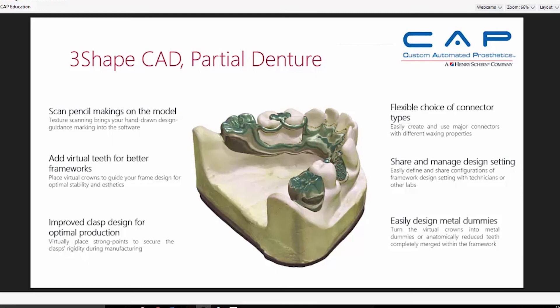Another nice feature 3Shape has added is the ability to add dentition during the design phase, ensuring connectors and mesh work are in the proper places. Especially with the lack of high quality dental technicians in the partial denture arena today, having the ability to see the end product while you're doing the design can make removable laboratories provide improved partial dentures. It gives you the ability to include tube teeth, metal pontics, exotic connectors, and different kinds of lattice work.